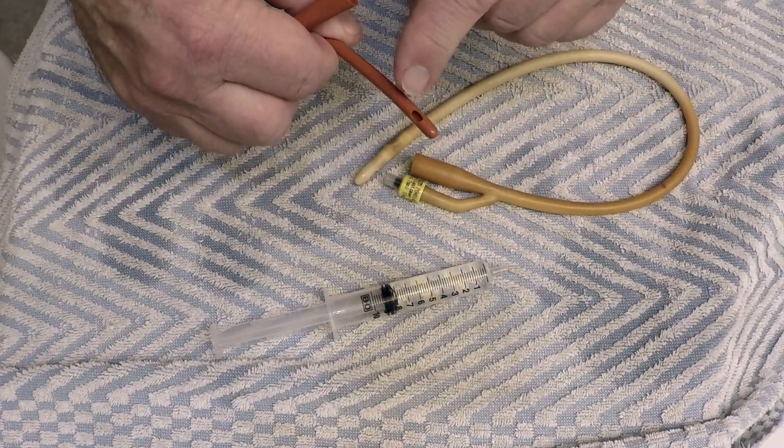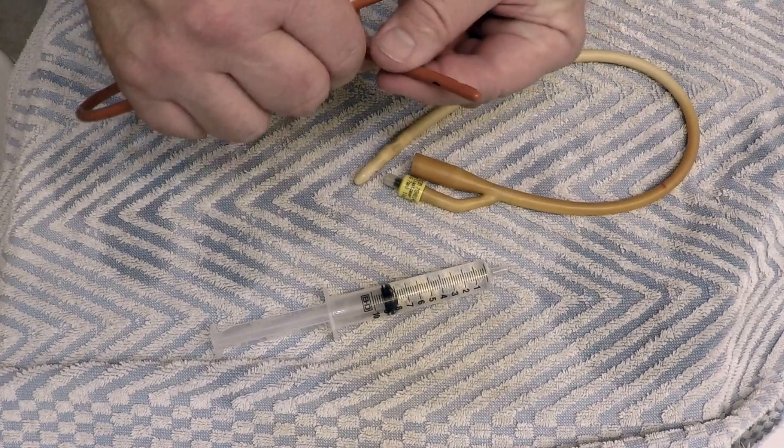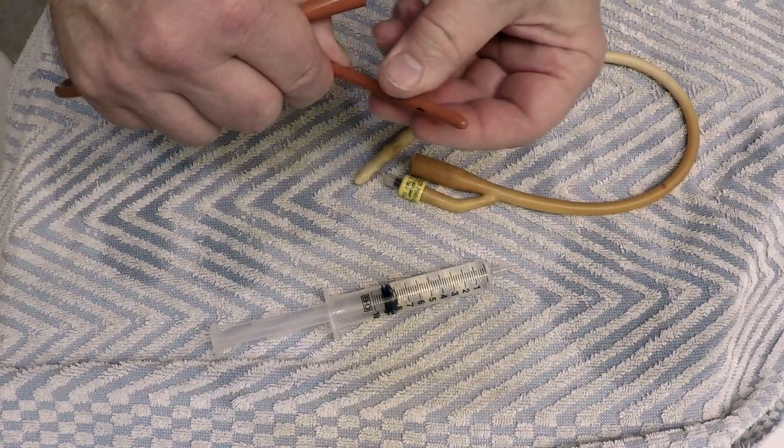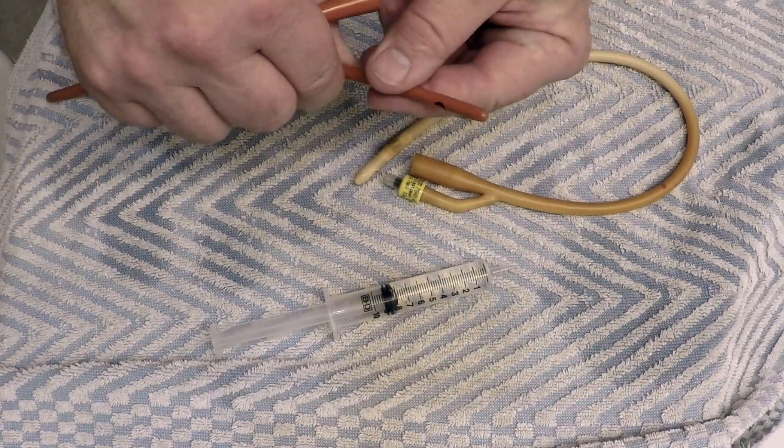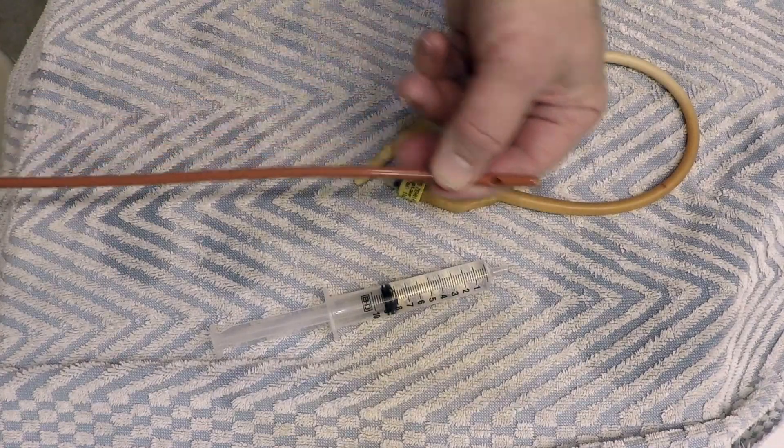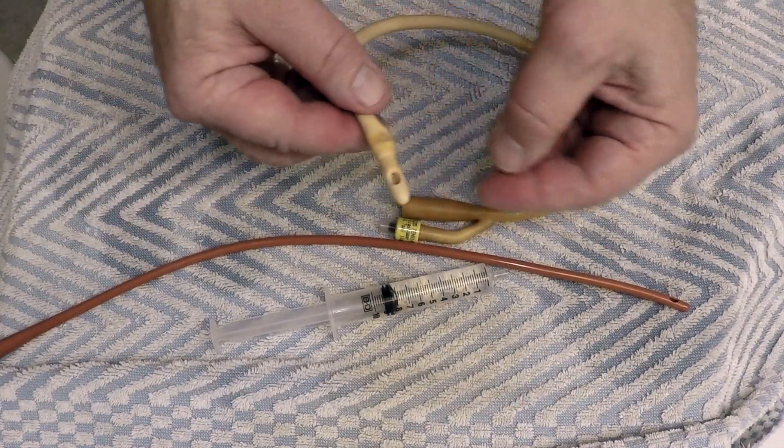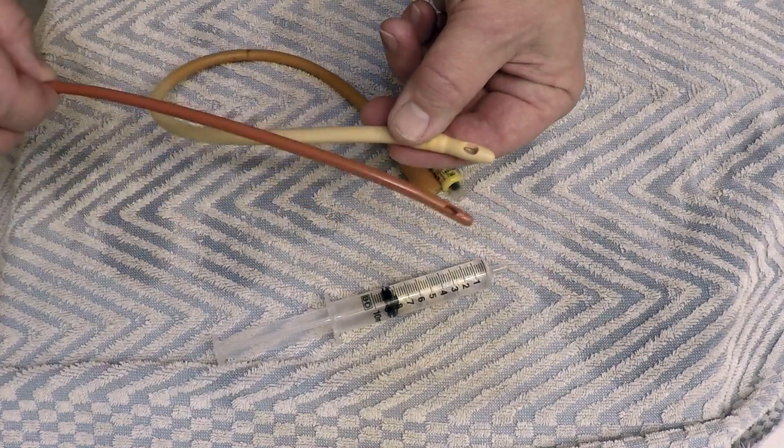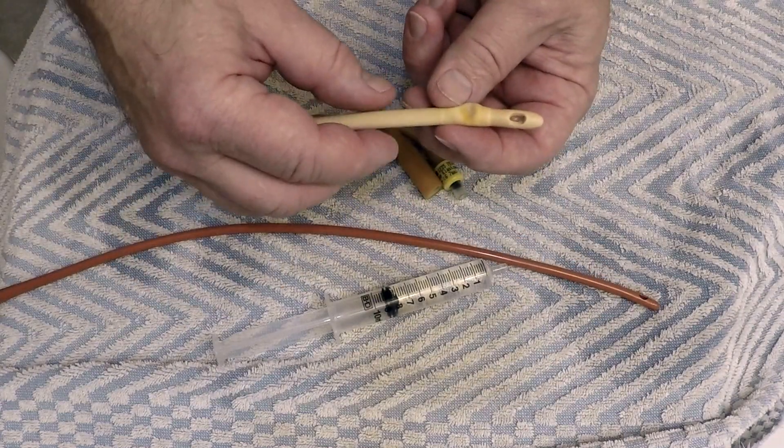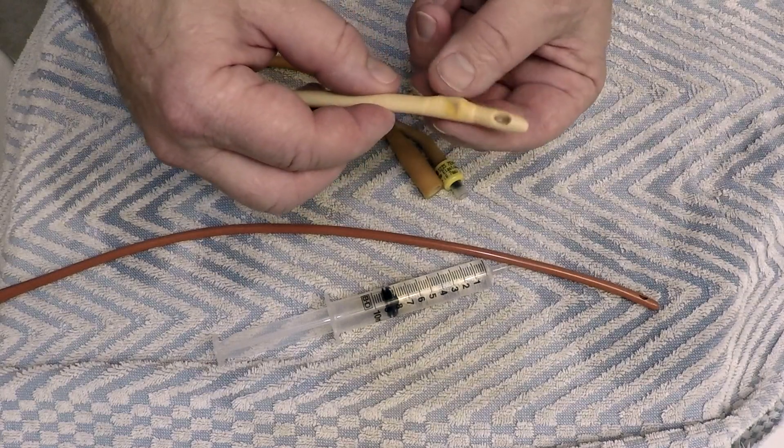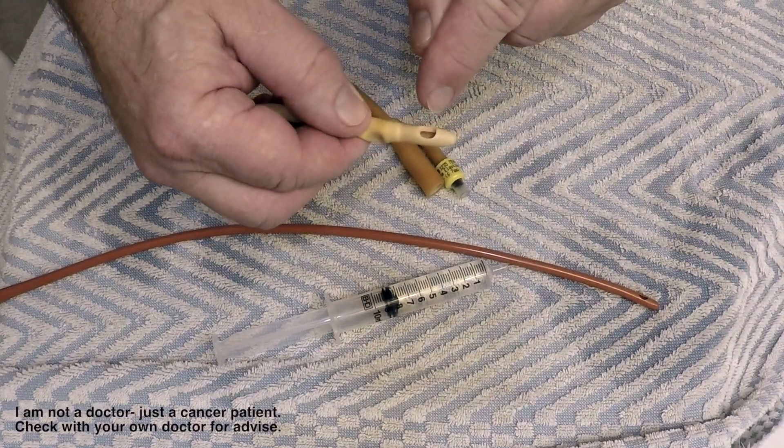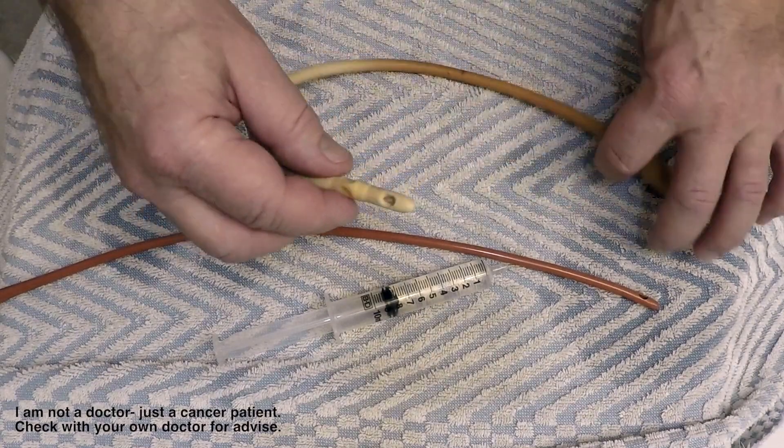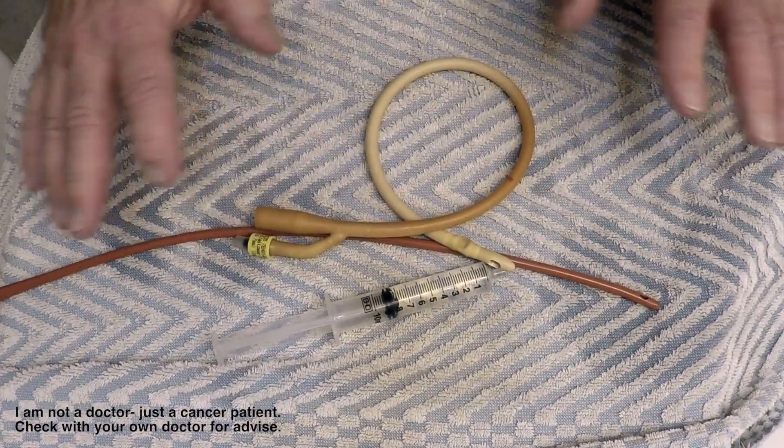This is just a regular catheter. It's just a pipe with holes on the end. The annoying thing is taking it out because these holes, this is silicone I guess, but it's not particularly soft. When these holes come out past the sphincter, that's when it hurts when you're pulling it out. This one hurt a lot less than I thought it was going to be. Taking it out today was a pleasure compared to taking out a regular catheter, probably because everything was stretched so big for the last week. This bulb was just coming out ahead of these little scraper holes. It was just nice to get it out. It was a little bit of a tug and then it was gone.